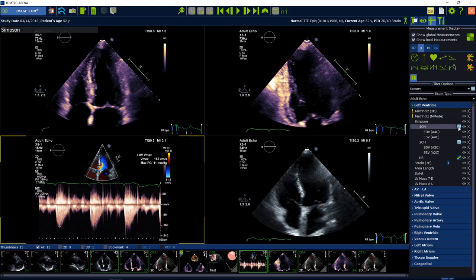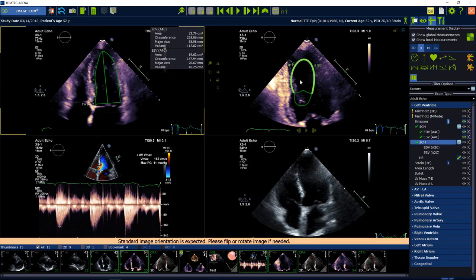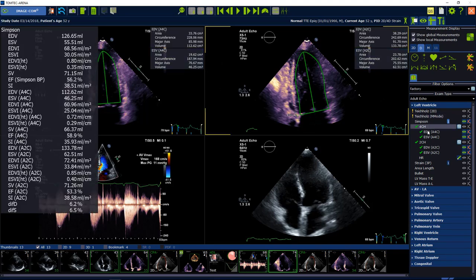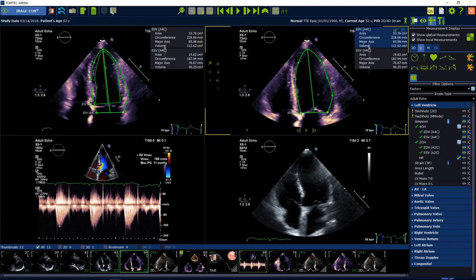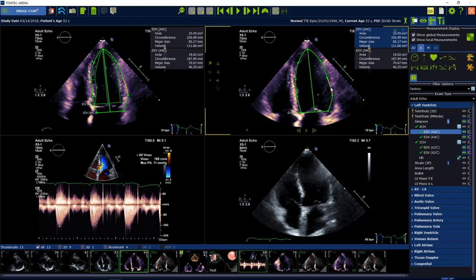Now click the automatic detection button and tell the software where to find the 4-chamber view and the 2-chamber view. Now you have automatically tracked the contour in end-diastole and end-systole. Of course you can adjust the contours — you can add points with a left mouse click and delete points with a right mouse click.